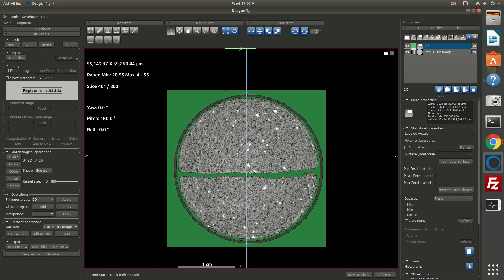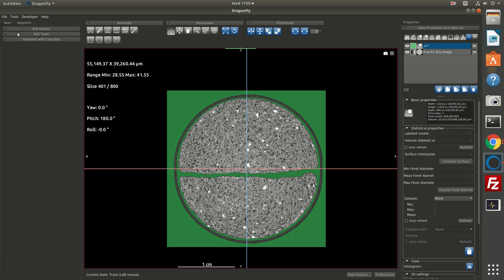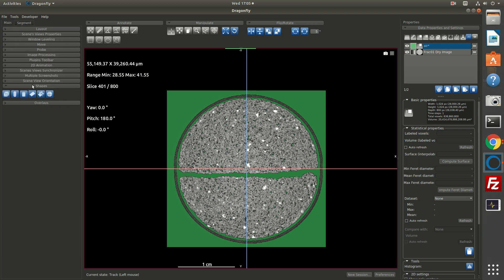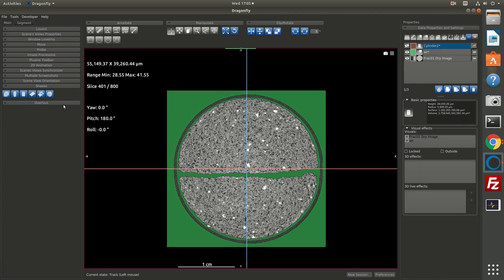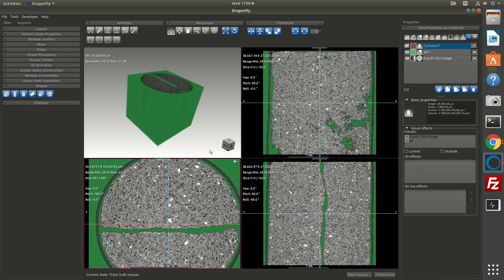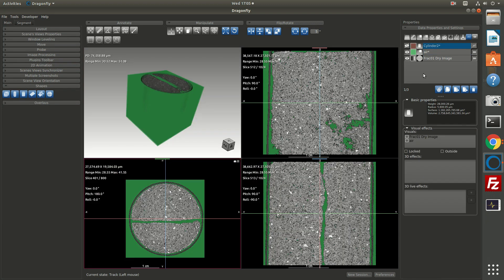Now in this case, we have a number of pixels that are outside this particular core liner, and our core sample happens to be cylindrical. So we can take advantage of that geometry and actually use a cylinder to mask our region of interest. So back on the main page, on the main tab, you'll find a panel called shapes. And it allows you to create a number of shapes. I'm going to create the cylinder shape by clicking on that blue button.